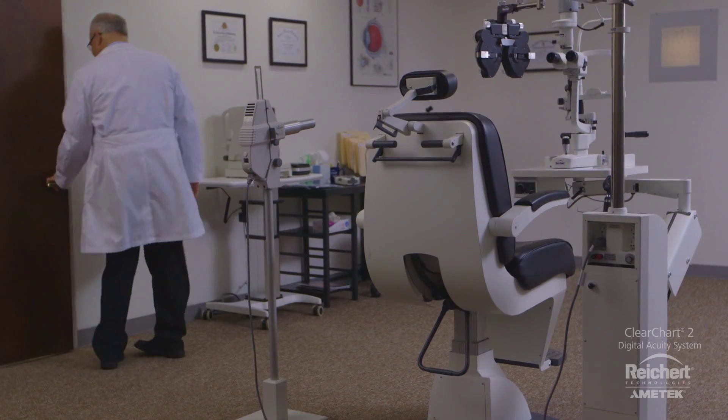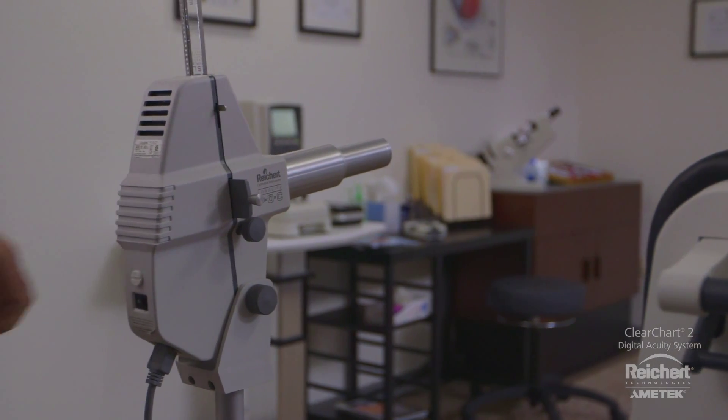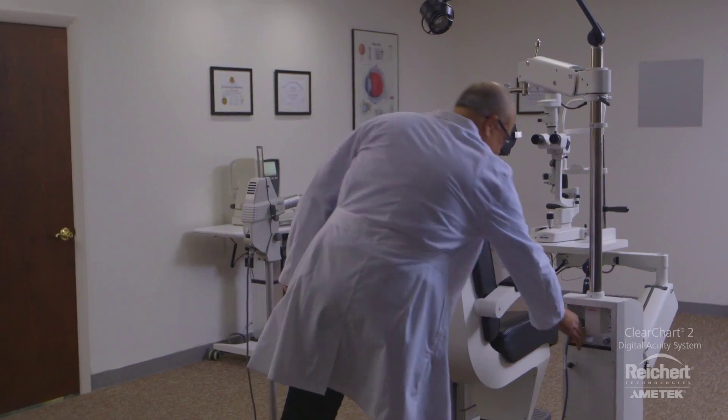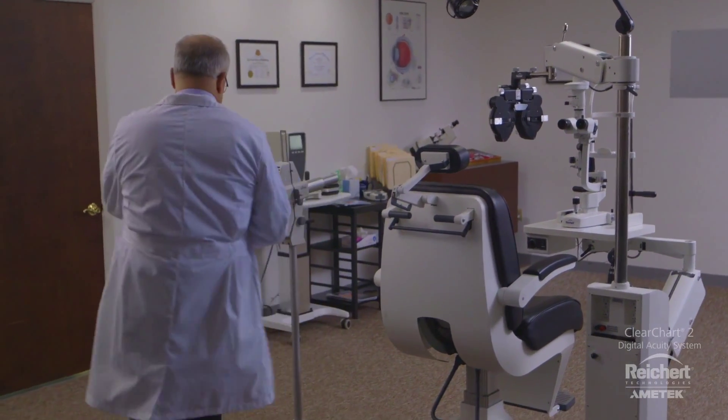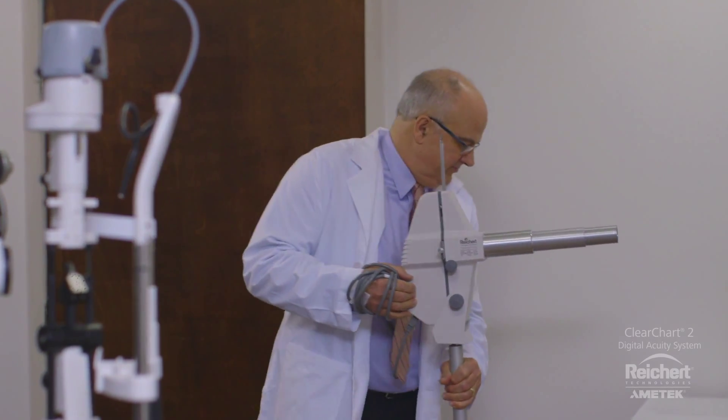Today is the day. Dr. Wilson is excited about taking his first step in upgrading to a digital lane. He's decided that the time has finally come to retire his outdated chart projector with something that can keep up with his busy practice.